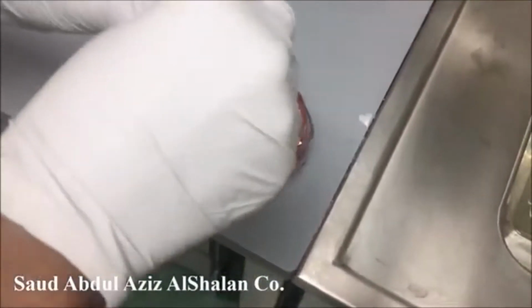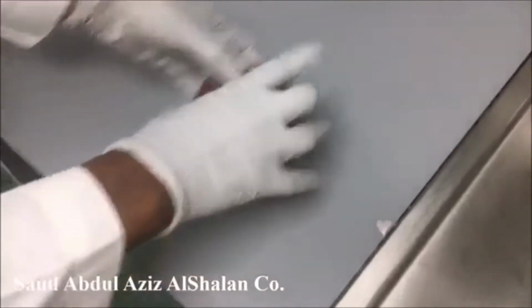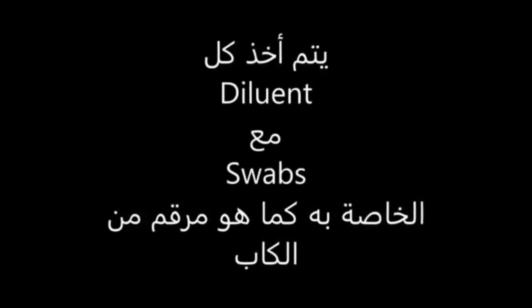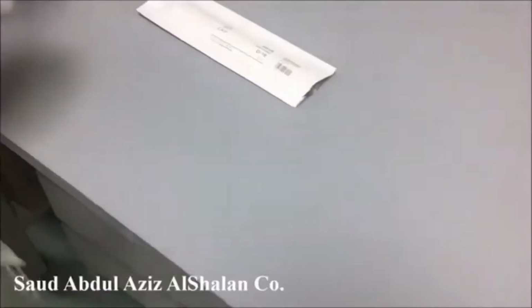Now we are done with the first specimen, which is D15.